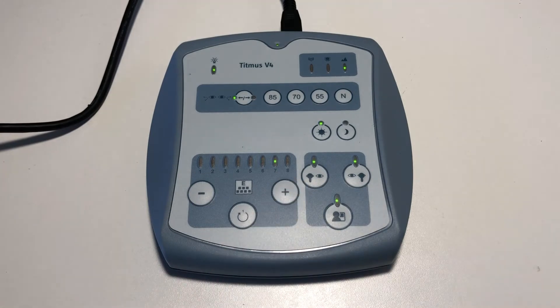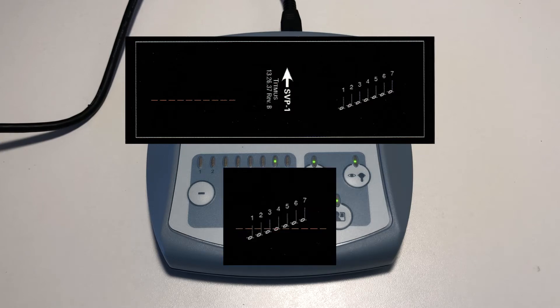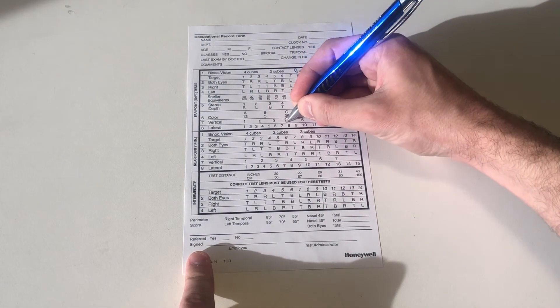Advance to slide number 7. This slide is testing for vertical phoria. The patient should see a combined image that looks like this. Say to the patient: when you look at the slide, you should see a red dotted line passing through a musical note with a number. Tell me which number the red dotted line passes through as soon as you see it. Ensure that the patient answers quickly, as the line may appear to drift over time. Record the number on the record form.